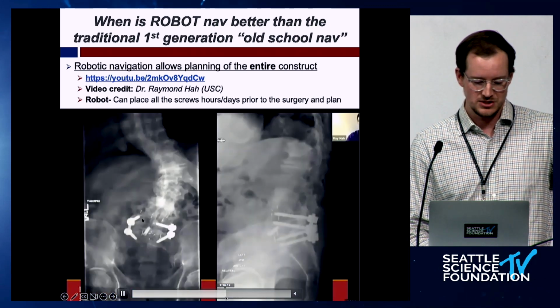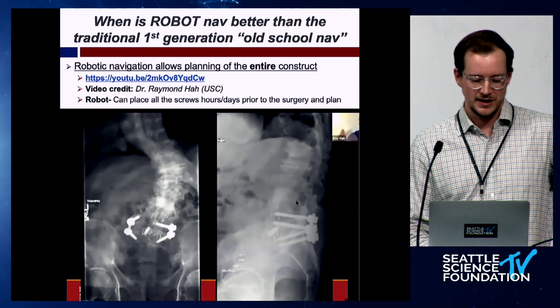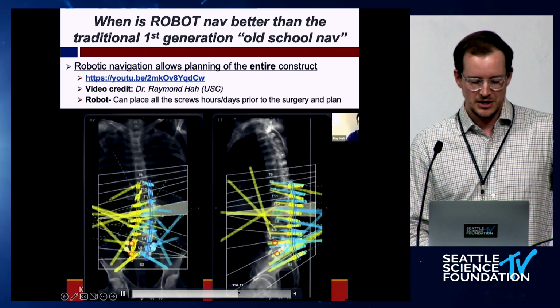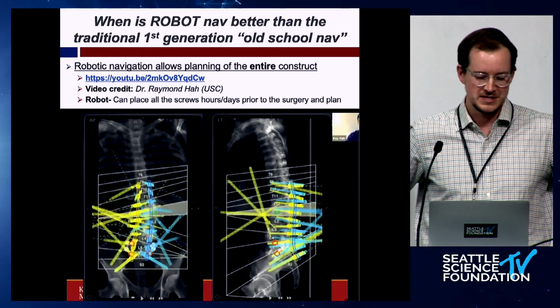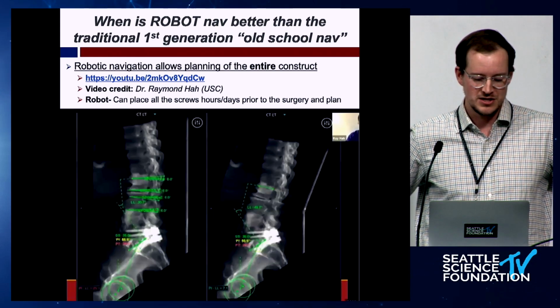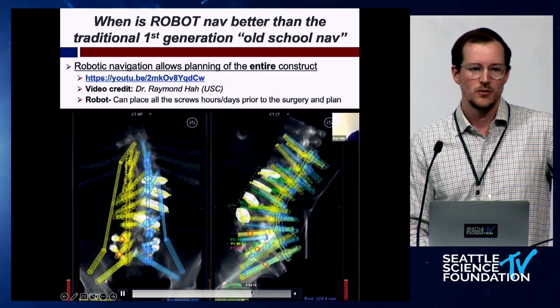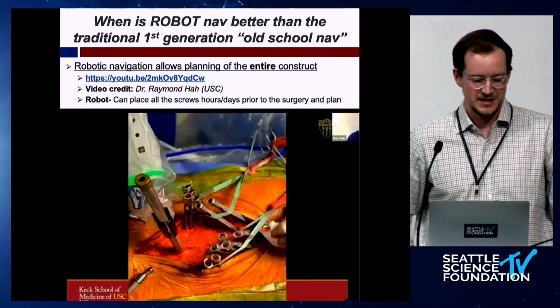Here's another, third case he shows of huge deformity. If you just do the O-arm spin and plan this in the OR, that's a lot of brain power. That's a lot of work. That's a lot of thinking on the fly. Whereas if you do this with the robot, look how crazy that looks. But if you're using the robot, that makes it quite simple. The expression he uses is it's a forest of towers. You can't see through that if you're using fluoro. There's no way using non-image navigation you can see through that, but this is how they did it.